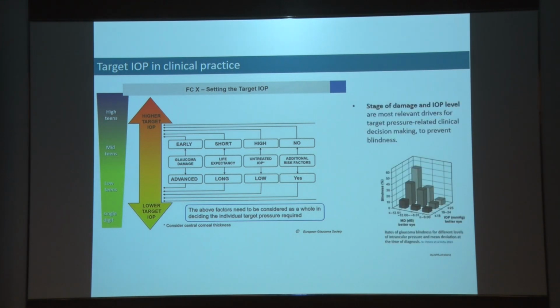The stage of damage and IOP level are the most important drivers for target pressure related clinical decision making to prevent blindness. Thank you.